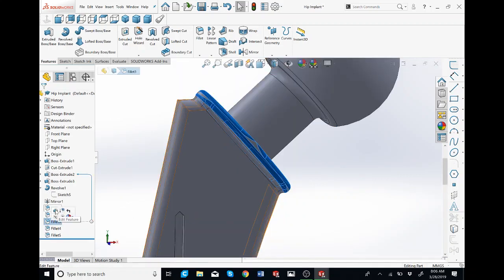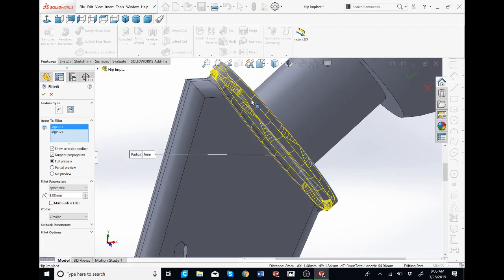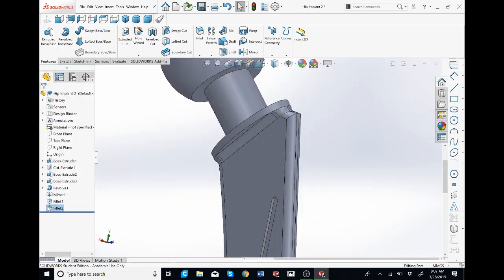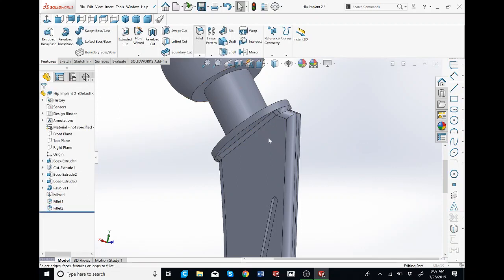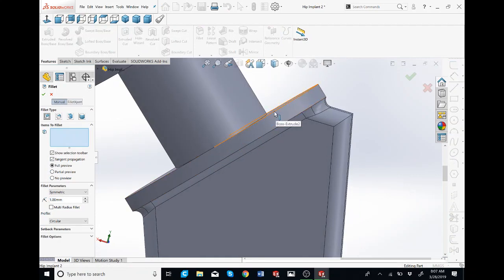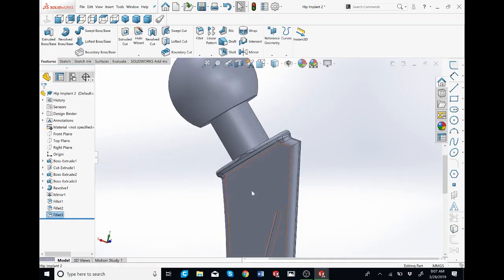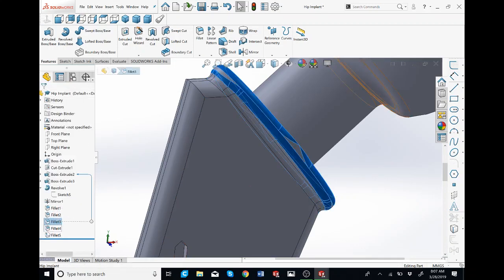I think this video is getting pretty long, so I'm just going to kind of speed through this. So 1 millimeter for this one, and you see those two edges. Check this one and see if it's 1 millimeter or 2 millimeters. So this one's 1 as well. So I'm going to edit it. Make this 1 millimeter. Check. Fillet this. Sometimes you can actually do it all at once, but I believe when I tried this the first time, they would not let me. So I had to do it one by one. Good. And I think I have 2 fillets left.